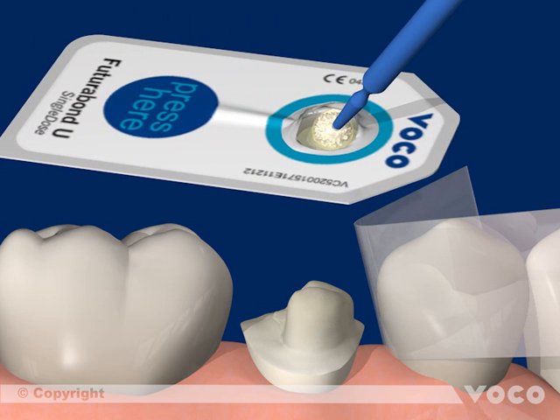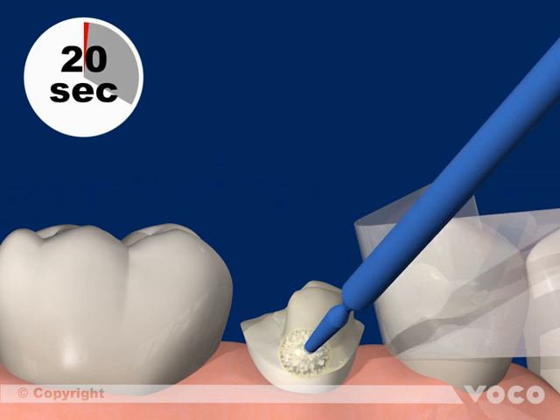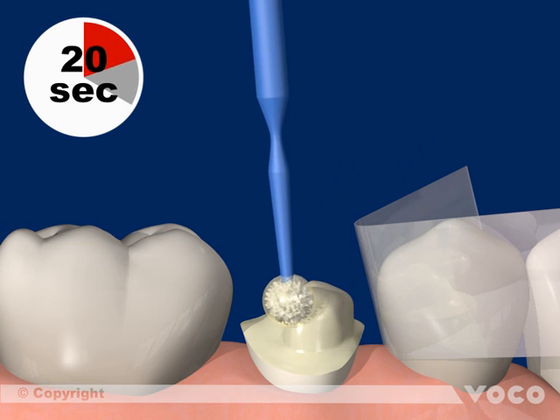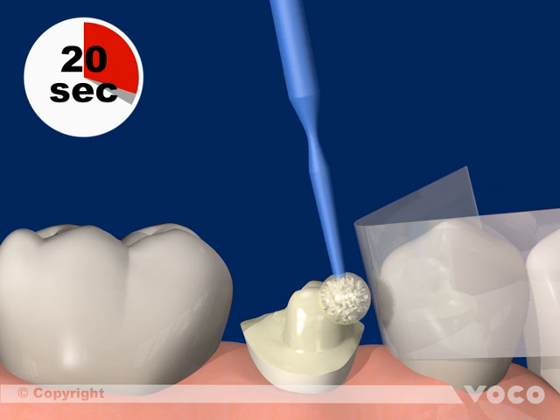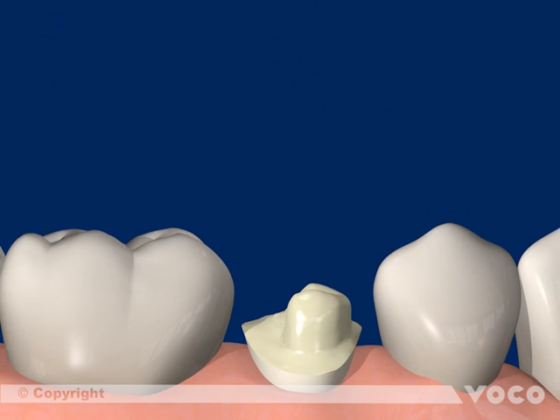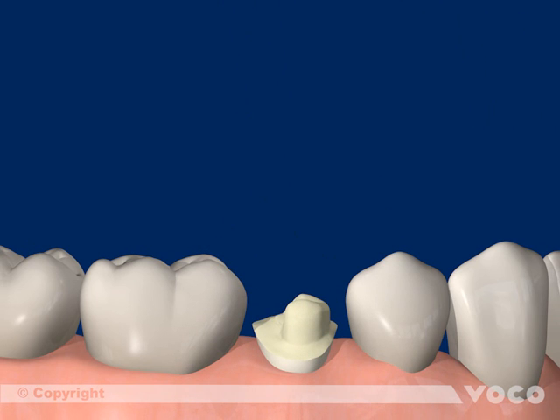The existing crown is completely coated with Futuro Bond U, which is rubbed in for 20 seconds. Drying the adhesive layer for 5 seconds will remove any remaining solvents.